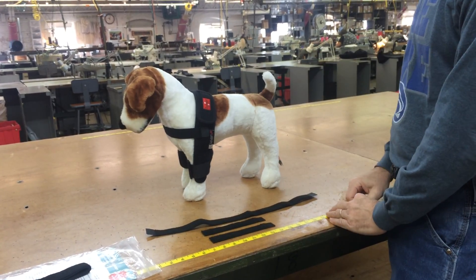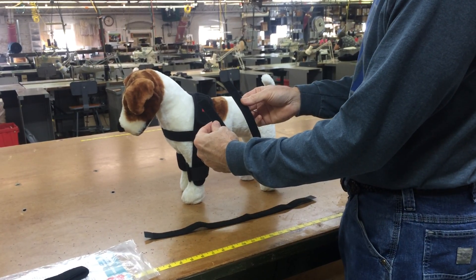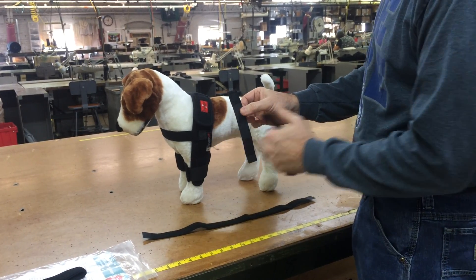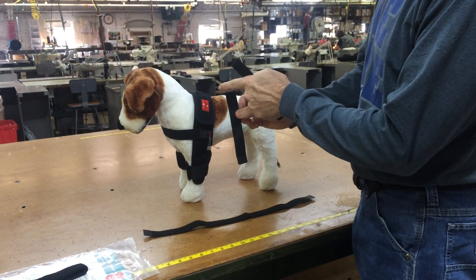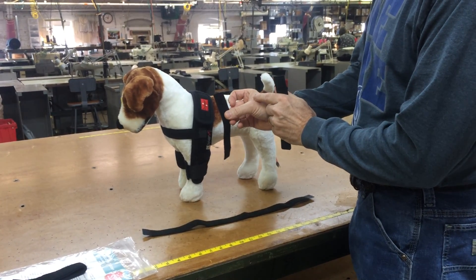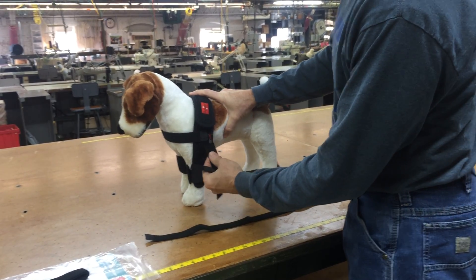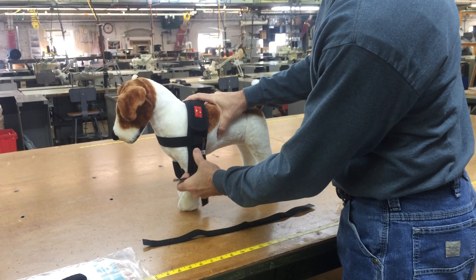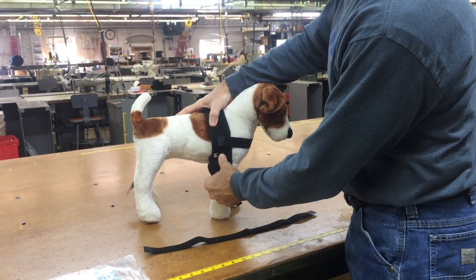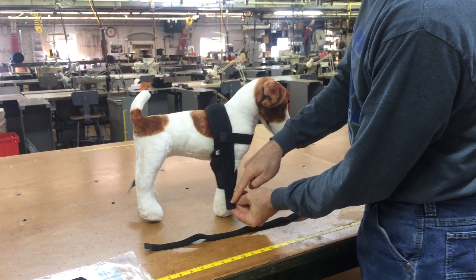The first step is to attach the hobble tabs to the left and right straps of the elbow sleeve. One end of the hobble tab has Velcro hook that is even with the Velcro loop of the hobble tab. Attach this end of the hobble tab to the left and right elbow sleeve just below the chest strap, with the Velcro hook tab on the other end pointing downward.